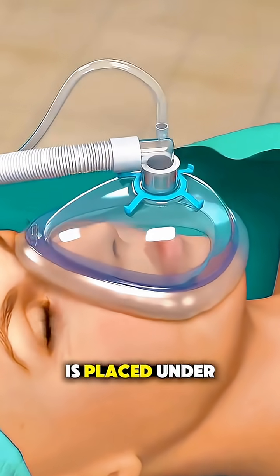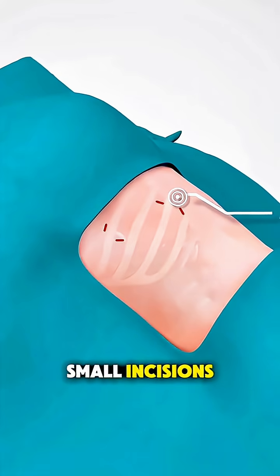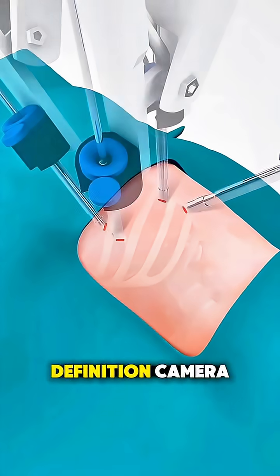First, the patient is placed under general anesthesia so they're completely asleep and comfortable. The surgeon then makes a few small incisions, usually between the ribs, to create entry points for tiny robotic instruments and a high-definition camera.